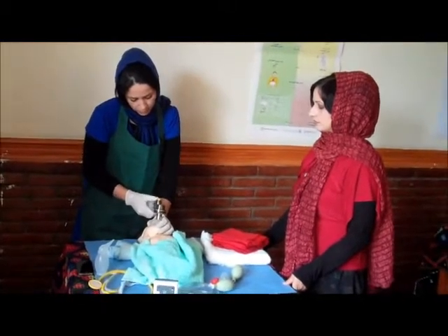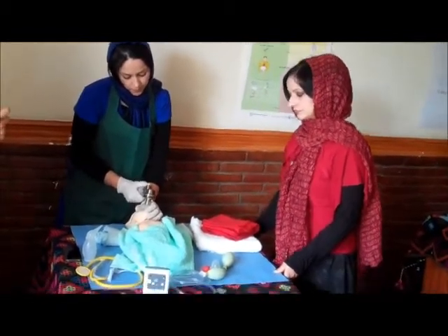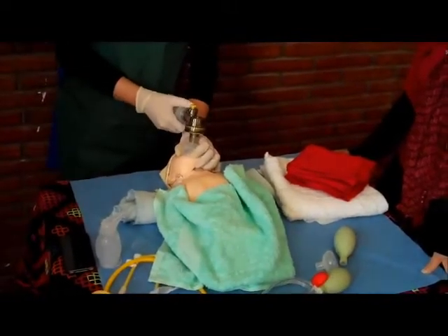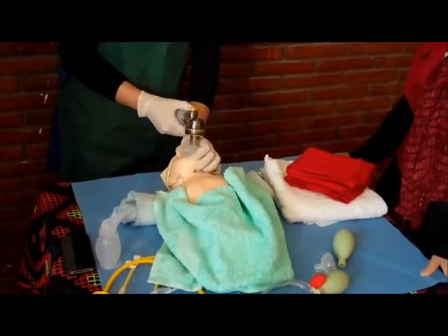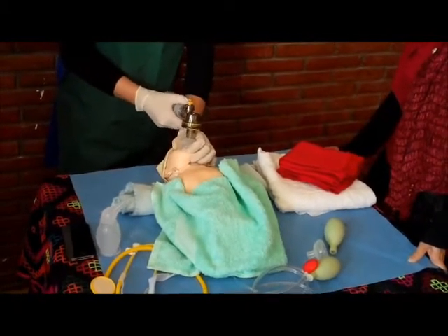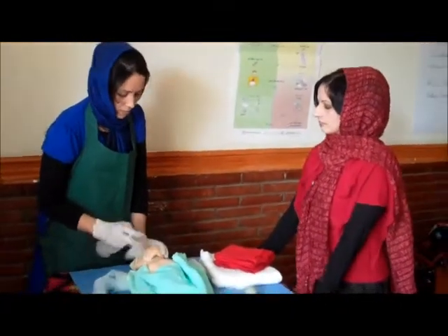We count the ventilation breaths: 1, 2, 3, 4, 5, 6, 7, 8, 9, 10, 11, 12, 13, 14, 15, 16, 17... continuing to about 40 breaths in one minute.